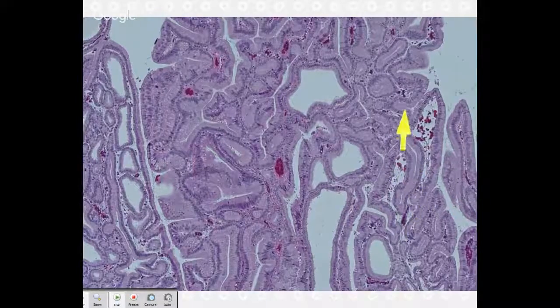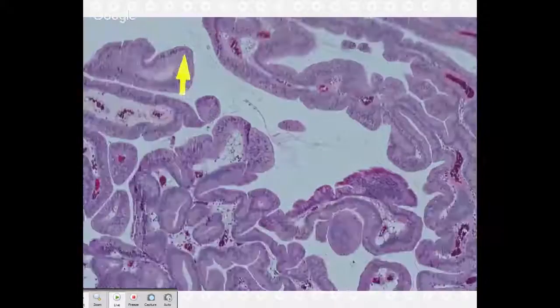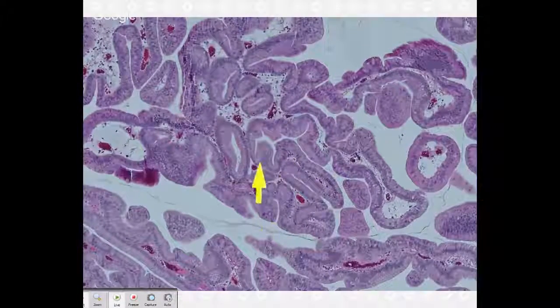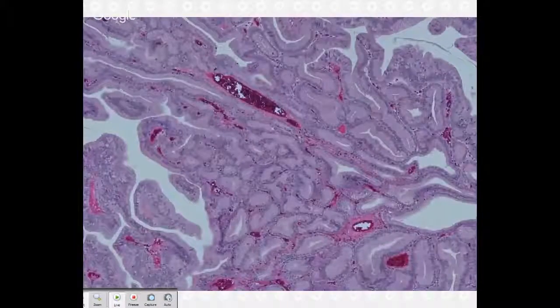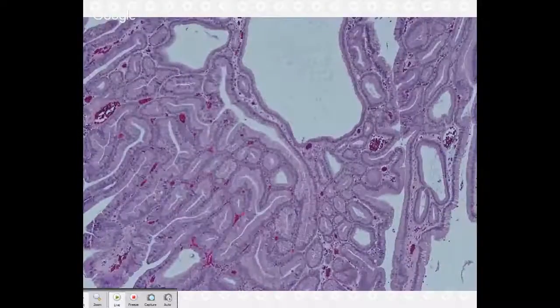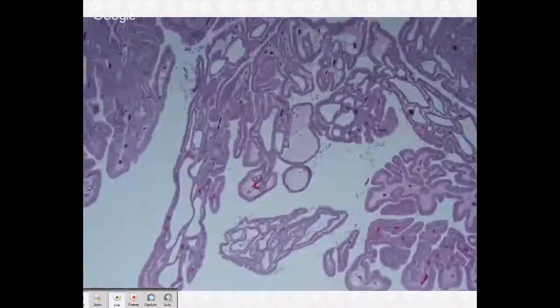Cytoplasm. Cells mainly respect the basement membrane. Mainly columnar, like low columnar to medium columnar type cells. The nuclei are not quite cigar shaped, but not perfectly round either. Back to back to back to back glands. If you saw an area where the nuclei started to get really round and a little bit more atypical looking, you would worry about high-grade dysplasia.